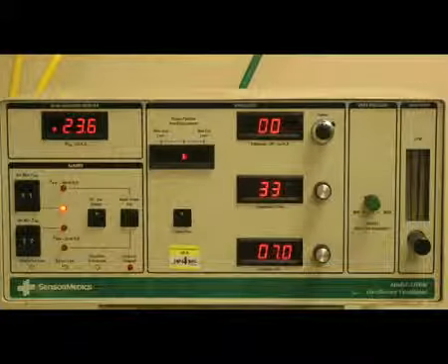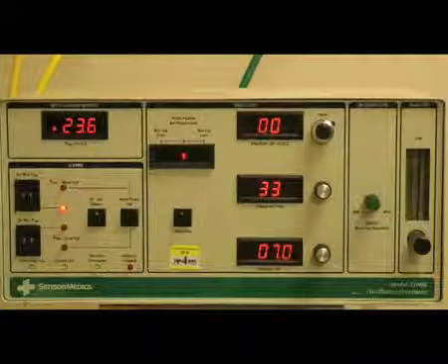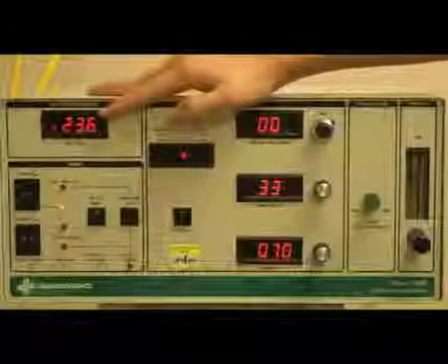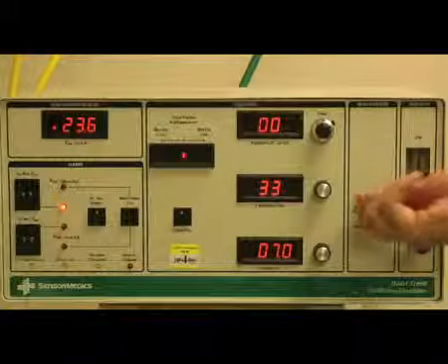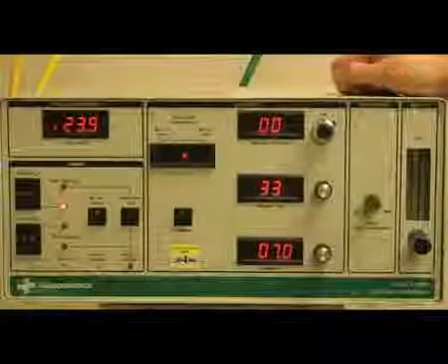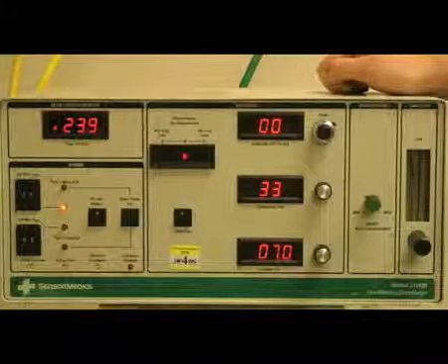For oxygenation management in a patient with ARDS on the high-frequency oscillatory ventilator, you have two main controls. You have your FiO2 and you have your mean airway pressure. The FiO2 is mainly adjusted by your oxygen blender, which is found on the lower portion of the oscillator, but is also affected by your mean airway pressure, adjusted with the knob to the right. Increasing clockwise will increase your mean airway pressure and vice versa. It is also important to remember that in order to monitor the FiO2, you will need an oxygen analyzer in line with the circuit and the flow meter that is attached to the blender.